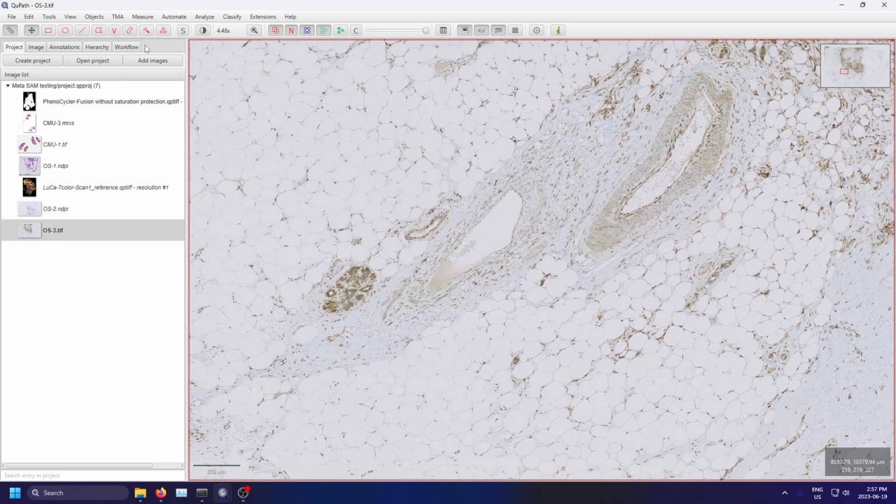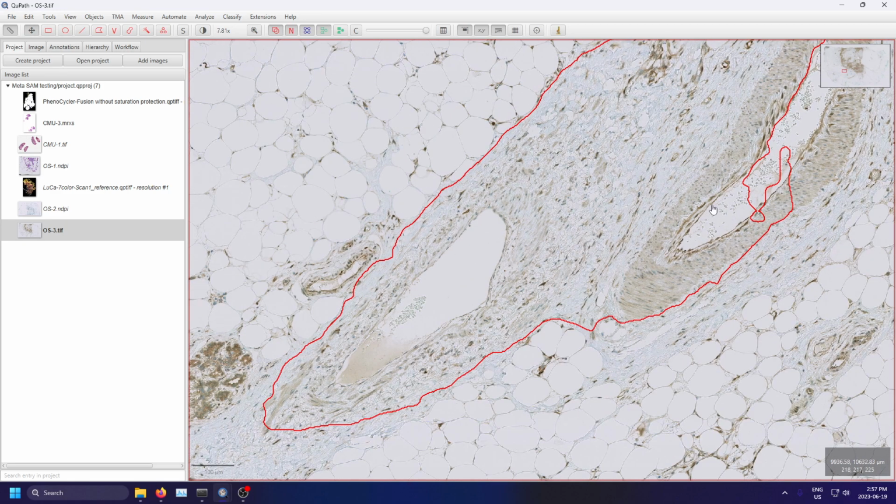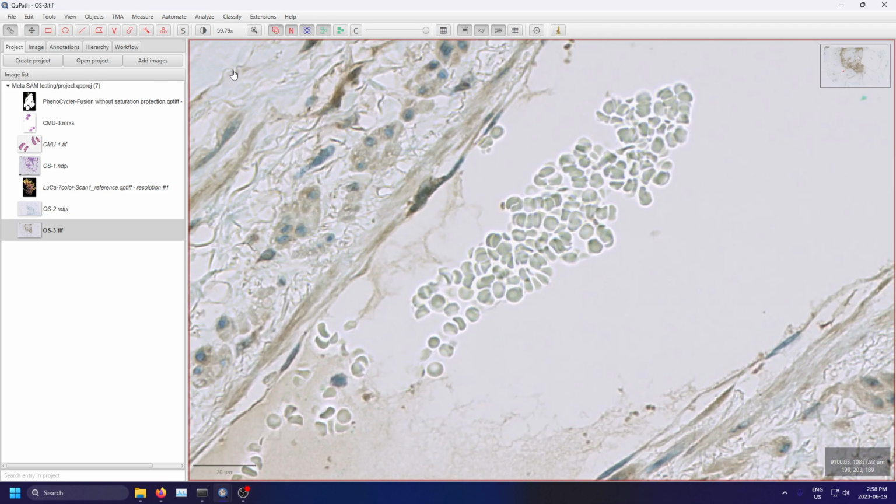And let's give it a shot at seeing if it can first identify some of these smooth muscle cells around the blood vessel. Might be a bit of a stretch here. Oh, pretty good. Let's take it one step further and detect only the lumen of the blood vessels. Excellent. And one step further, some stray erythrocytes that miraculously weren't washed off during the staining procedure. Yep, detects those as well.